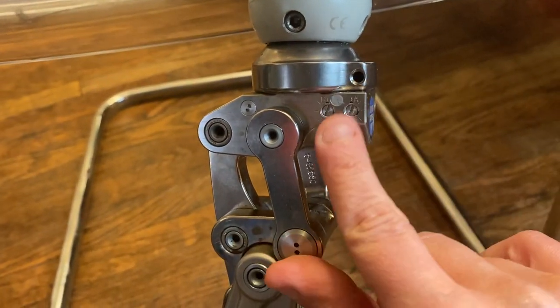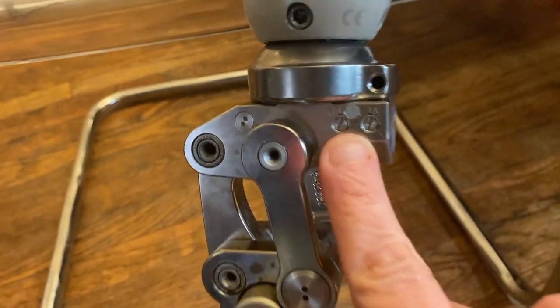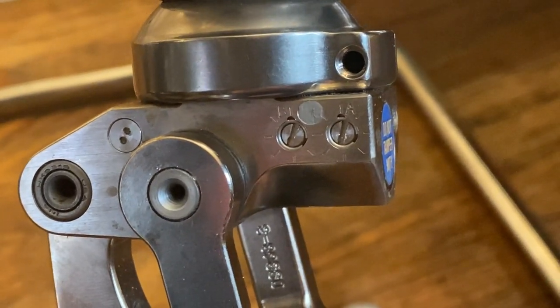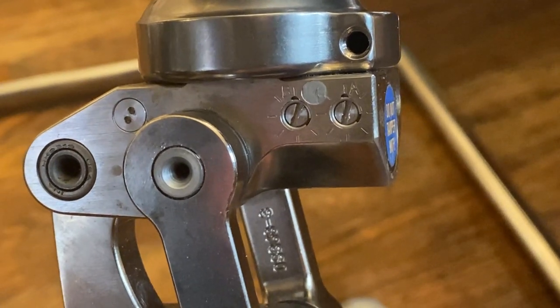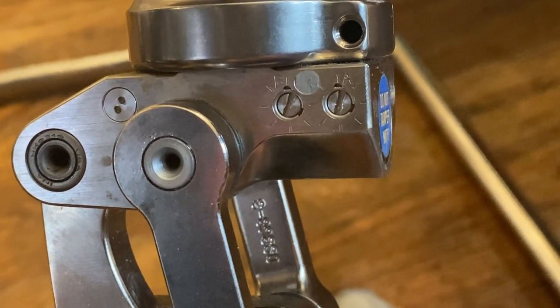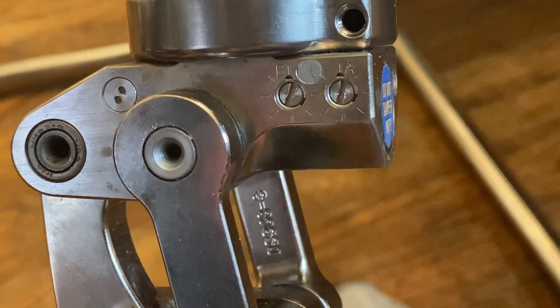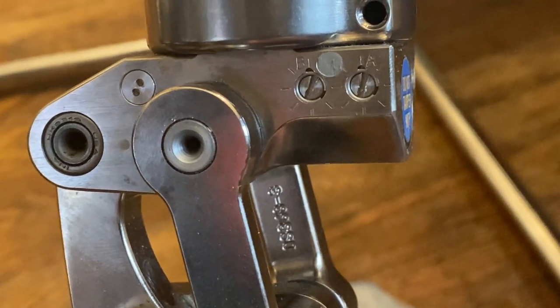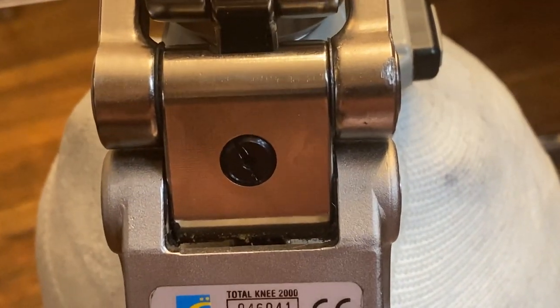If you look here on the side, you can see there are little screw-looking things, and those are so that you can adjust the flexion and extension. I don't remember exactly what they do — I'd have to look in the manual. But if you look online, there's actually a manual for this knee that explains how to adjust the flexion and the extension. There's also another adjustment knob there.